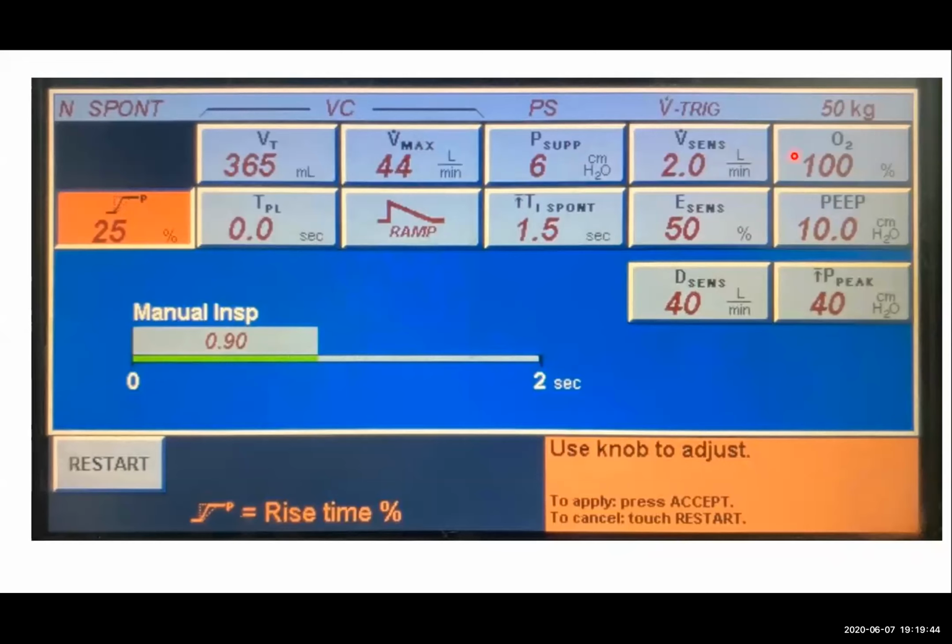Most of the patients might start with 100% FiO2. Actually, when we start the helmet, with our experience, most of the patients always have the highest FiO2 before using the helmet, so the 100% is always required. PEEP, we recommend to use a minimum PEEP of 10 in this case, to start helping the patient with the helmet.